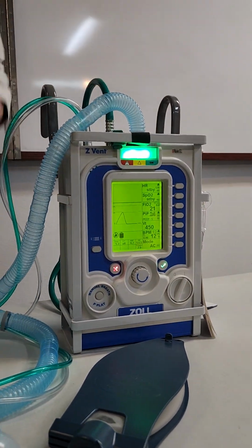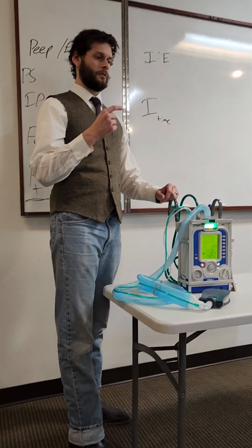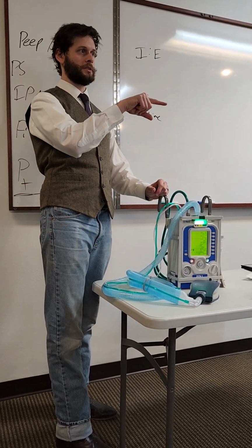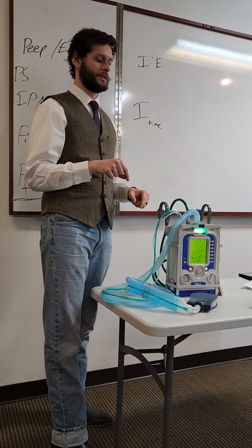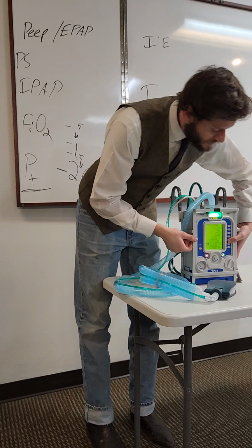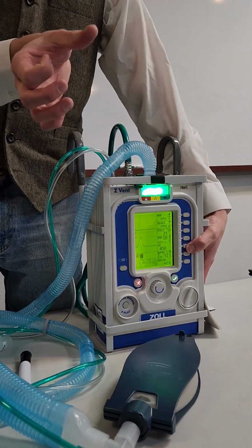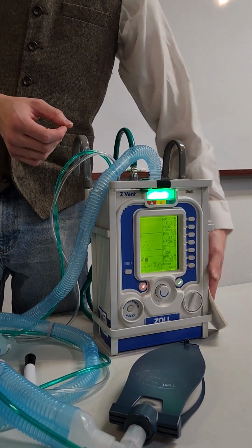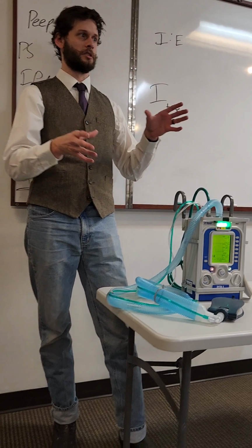So in terms of selecting things with this ventilator, with the new port, it was tap the screen, arrow, and accept it. This one is you press the button until you get to the parameter, twist your dial till you get what you want, and then accept it. Yeah. So they're both 3-step methods. It's just different means by which you select and change it.